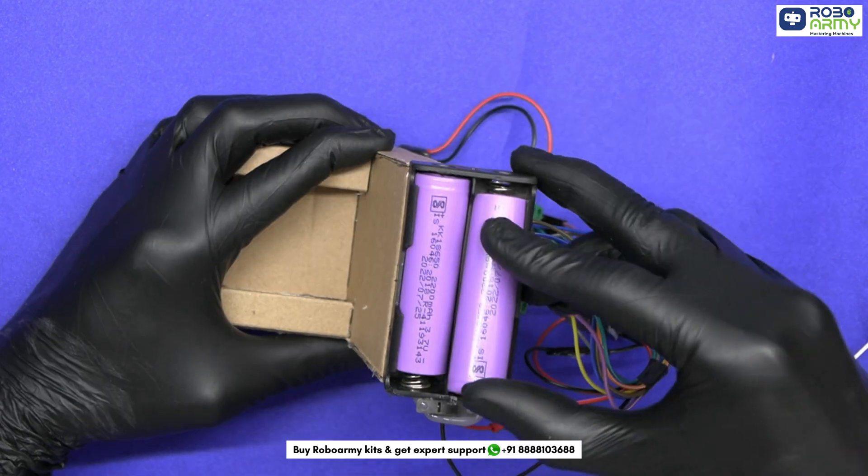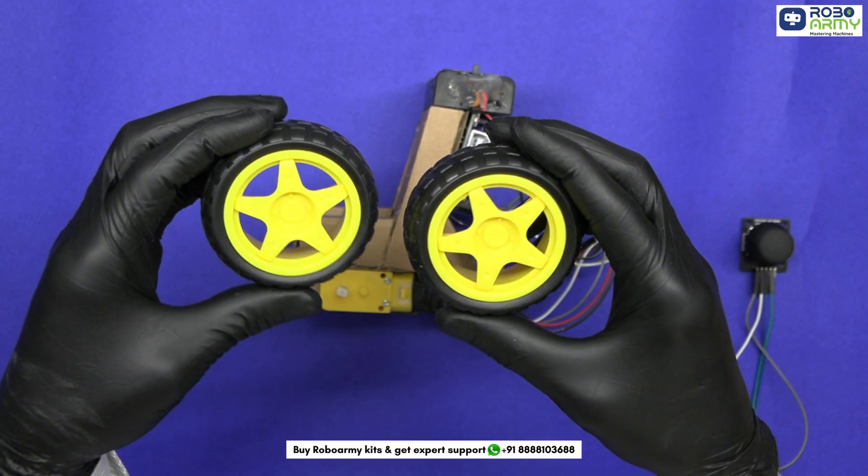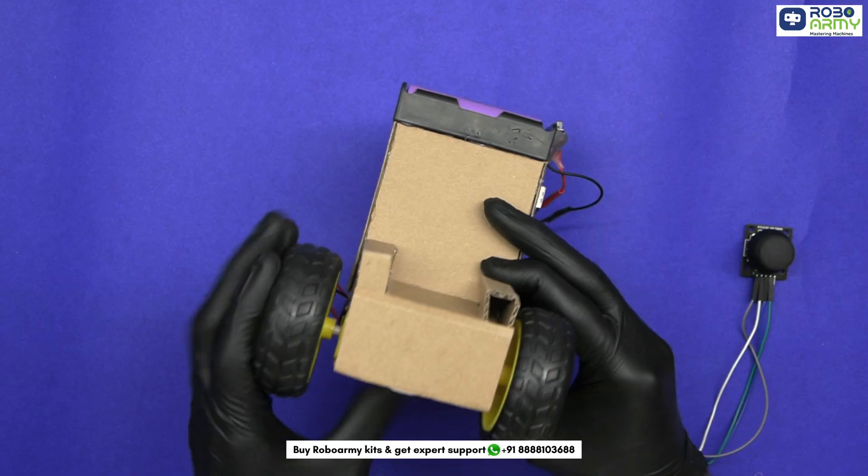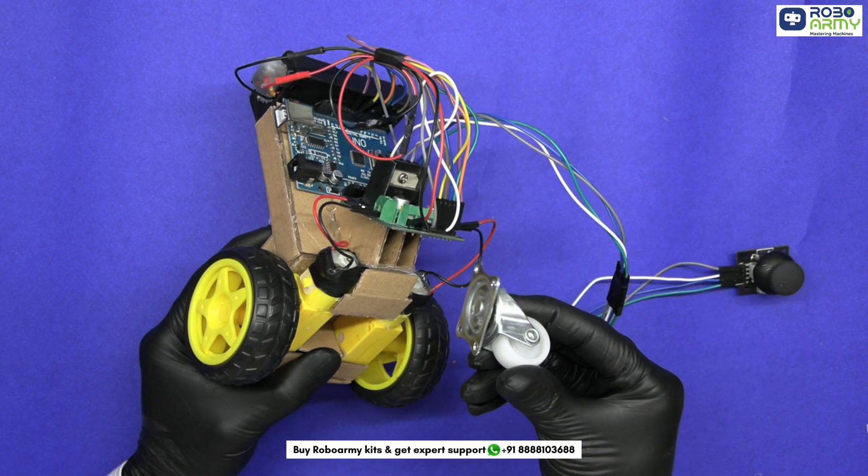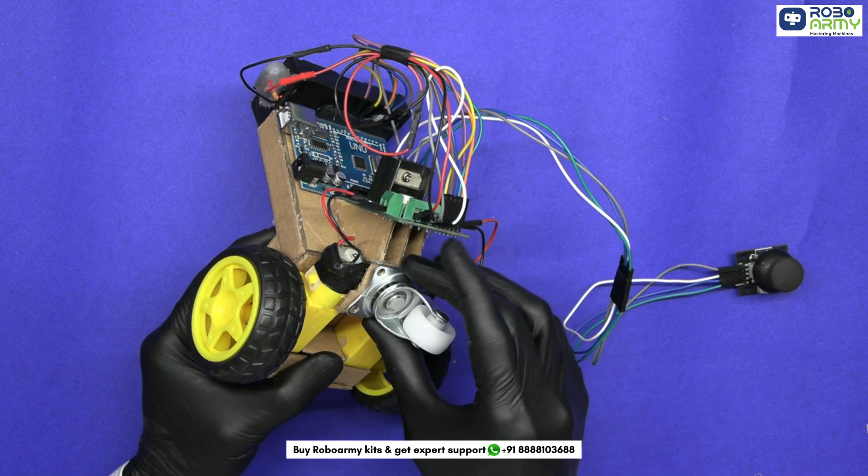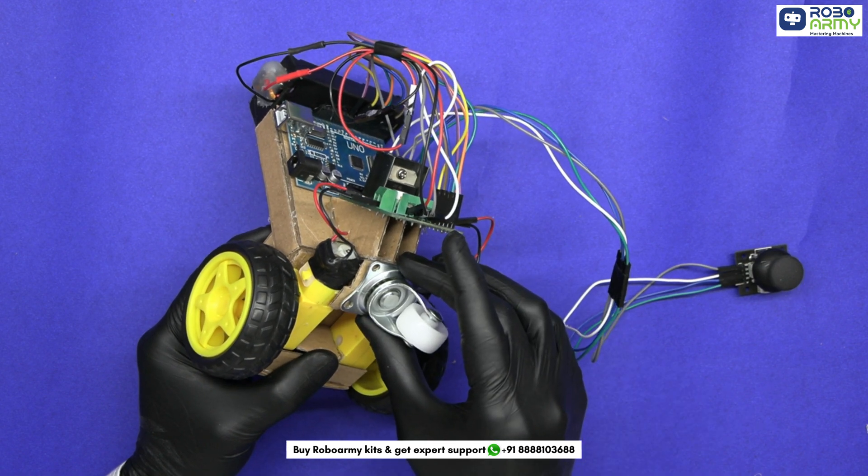Now insert the batteries in the holder. Attach the wheels to motors. Now place the caster wheel here as per the stability of the wheelchair.